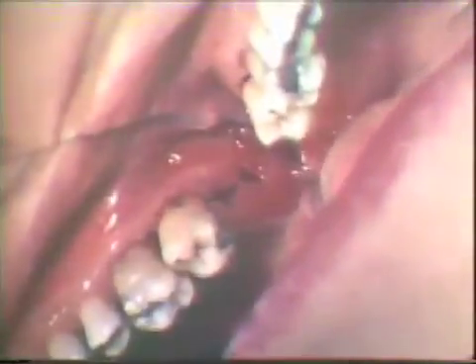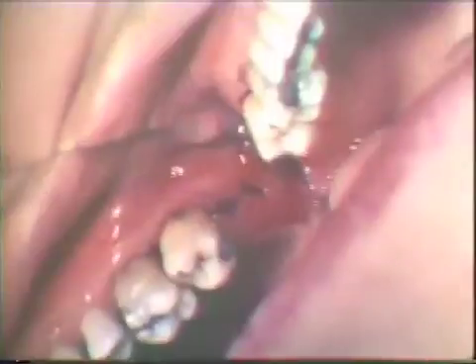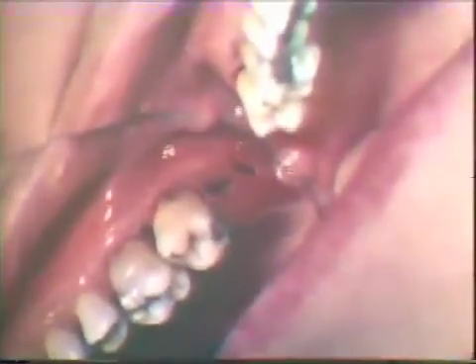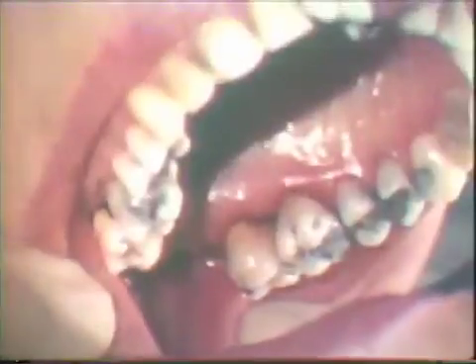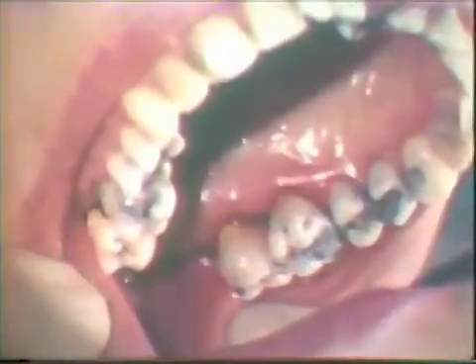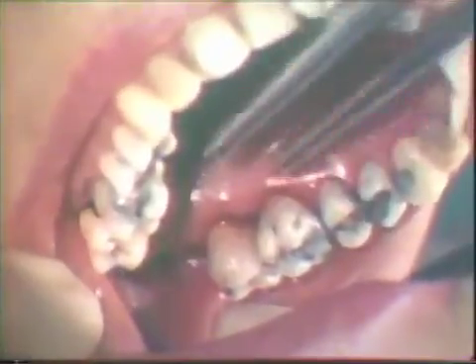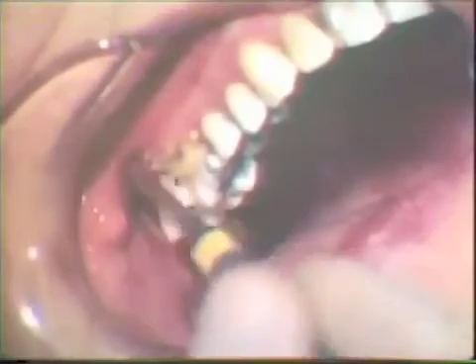A second suture is placed to further secure the buccal and palatal flaps. Notice that the tuberosity is reduced in size, but the soft tissue is closely adapted to the tooth. The free gingival margin has been positioned apically on the second molar as a result of the reverse bevel flap and the removal of underlying connective tissue.